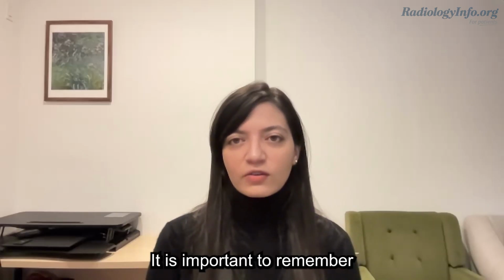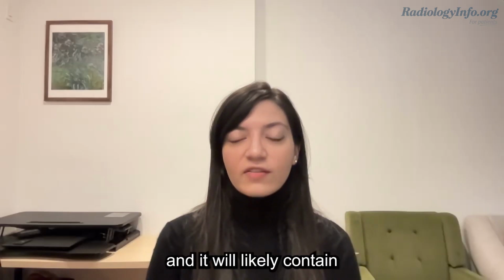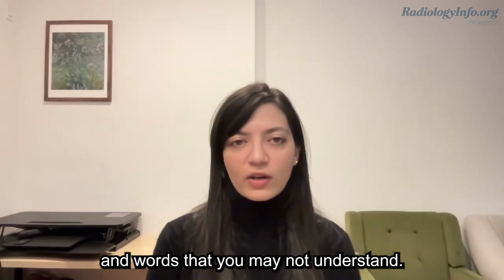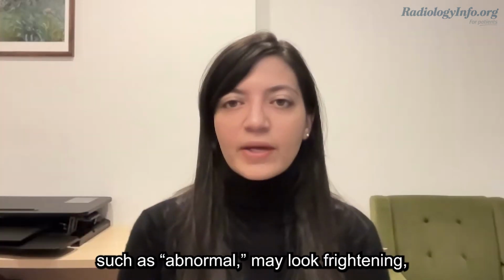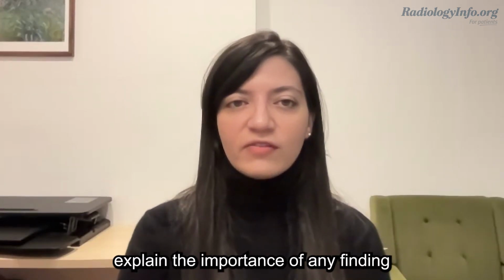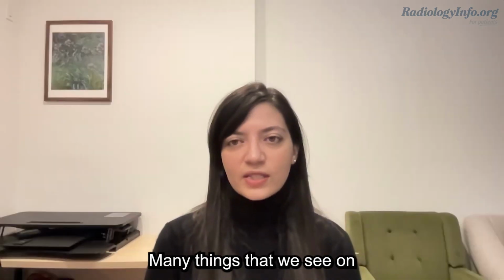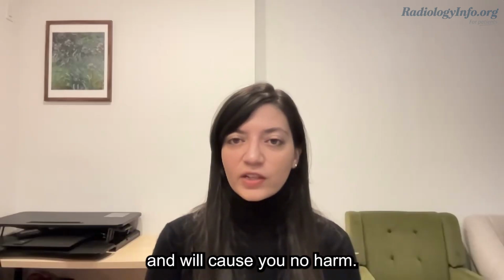It is important to remember the report was written for your healthcare provider, and it will likely contain medical terminology and words that you may not understand. Some medical terms in the report, such as abnormal, may look frightening but may not be as serious as you think. Your doctor can help explain the importance of any finding that the radiologist mentions in your report. Many things that we see on your imaging are commonly seen in many patients and will cause you no harm.